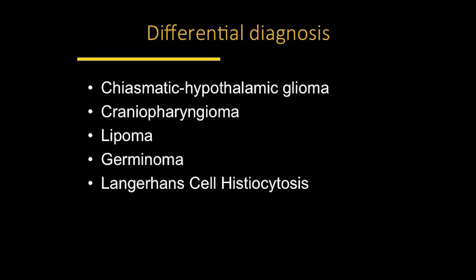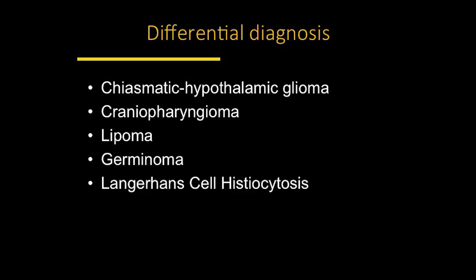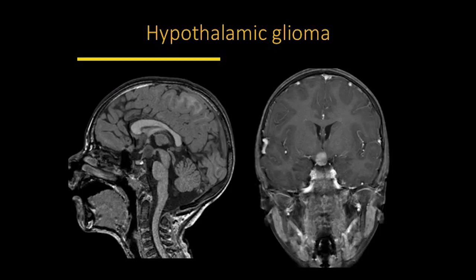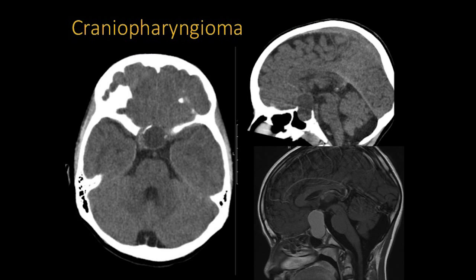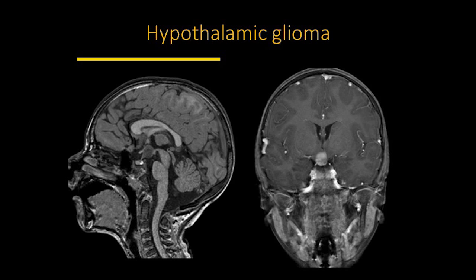There are other lesions in the hypothalamic region that form the differential diagnosis — some benign, some more aggressive tumors. For example, this T1 pre-contrast image shows a lesion within the hypothalamus that looks like a hypothalamic hamartoma. However, after contrast it lights up intensely — not characteristic of a hamartoma. This was a hypothalamic glioma. In general, these patients present with different symptoms: they usually do not have gelastic seizures or precocious puberty.